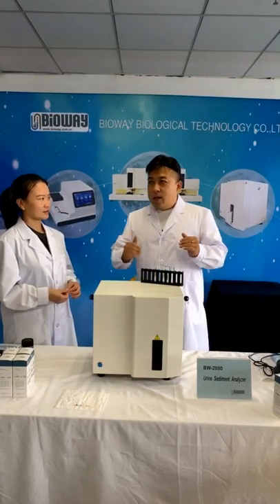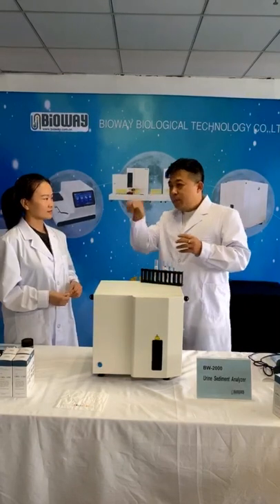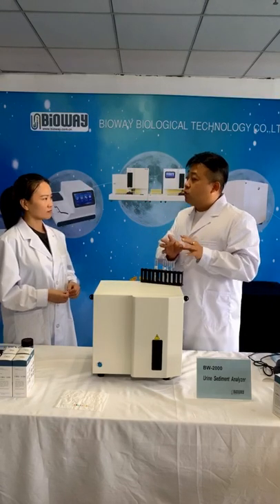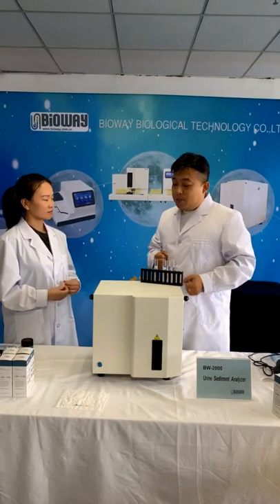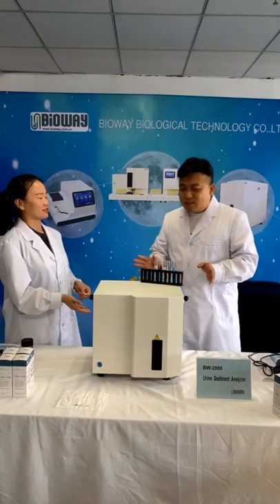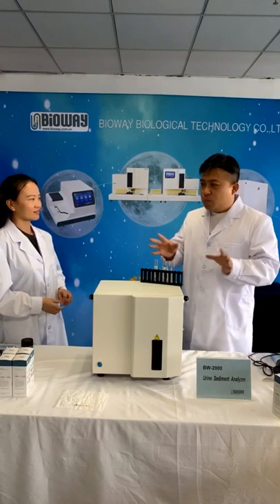Now, in the 1990s, the urine sediment analyzer was ready. But at the beginning the result was not very good. The needle gets the sample out and puts it by the microscope, and identification software finds the different cells and gets the result. Then it is sent to the doctor, and the doctor checks it again. But unfortunately the result was not good. The doctors never liked it and were never satisfied. They thought this is rubbish, a waste of money, and said, I never use it, I just want to use the microscope to test it.